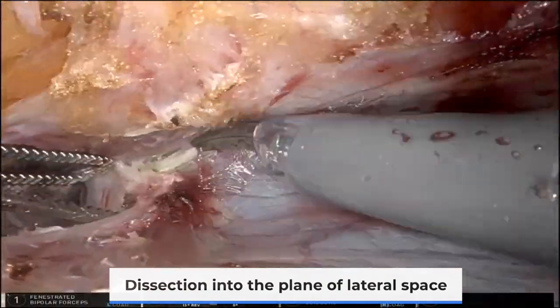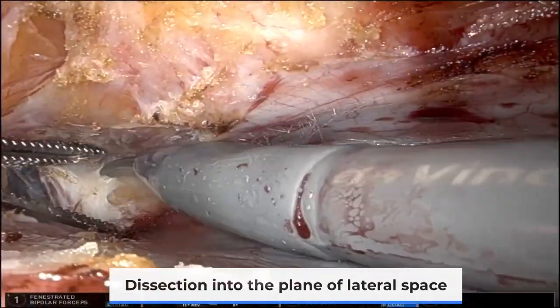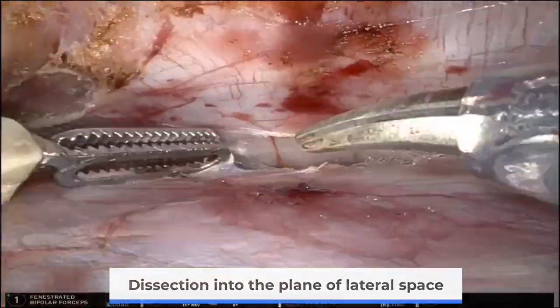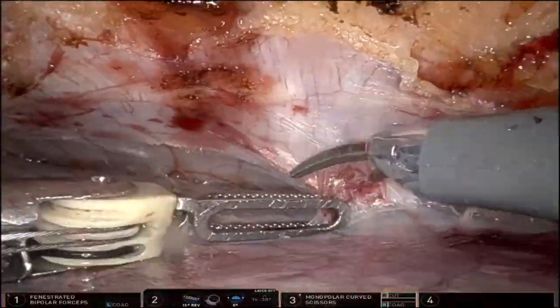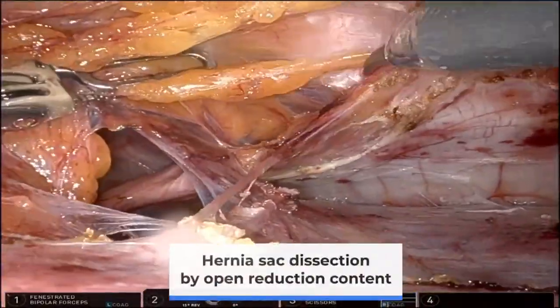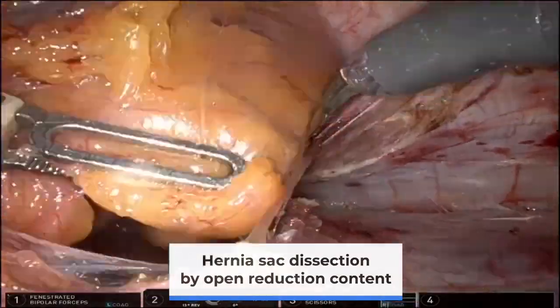Dissection into the plane of lateral space. Hernial sac dissection by open reduction of contents to prevent inadvertent small bowel injury.